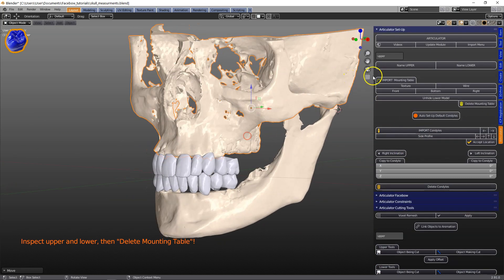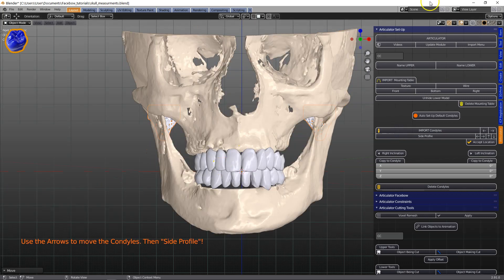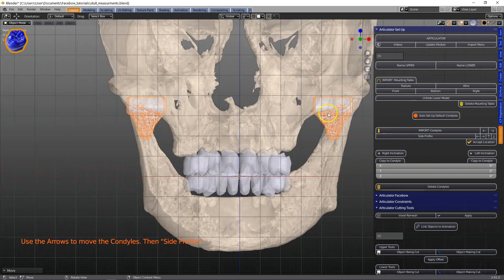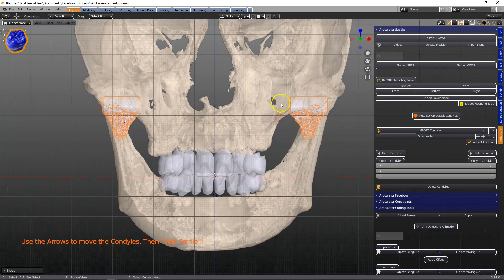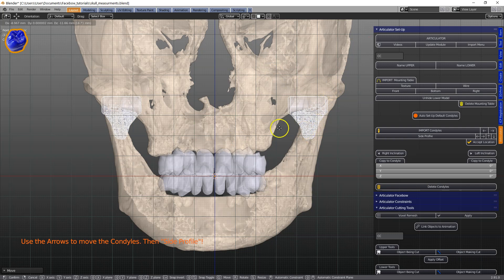Let's import the two condyles. In transparent mode — in the previous version they used to be in edit mode, but no longer. You cannot move them using G; they are stuck so that they cannot be moved in the wrong direction.